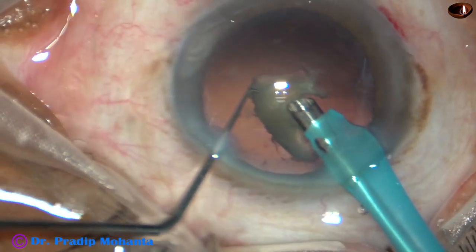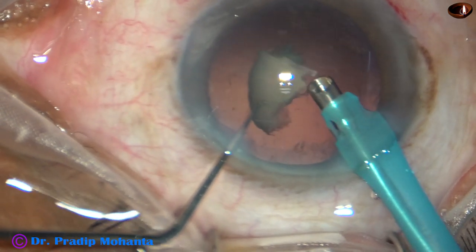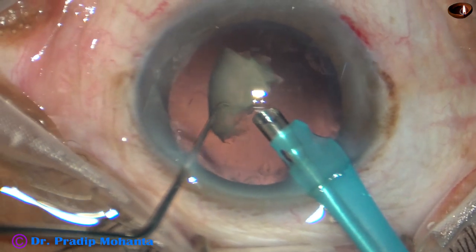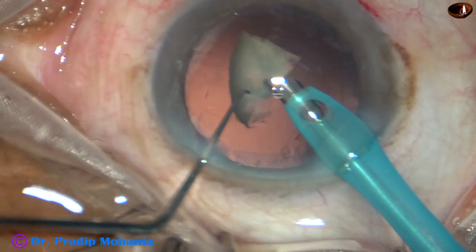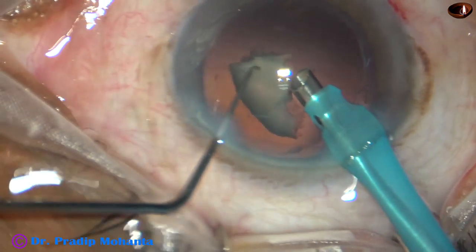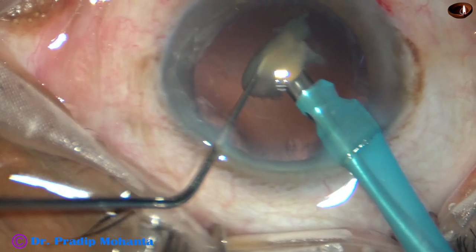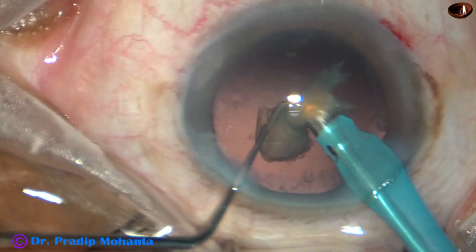As I try to emulsify this, I have caught the posterior capsule. I remained still and used reflux to release it — I didn't move. Whenever you catch the posterior capsule, don't move. Just use reflux. Most of the time you can release the posterior capsule.